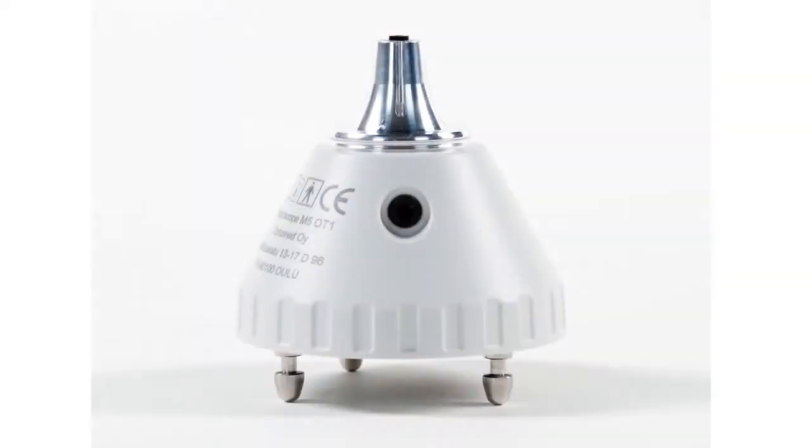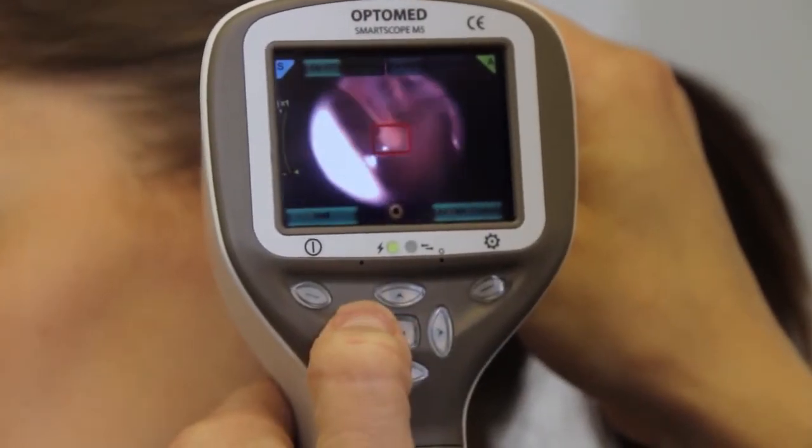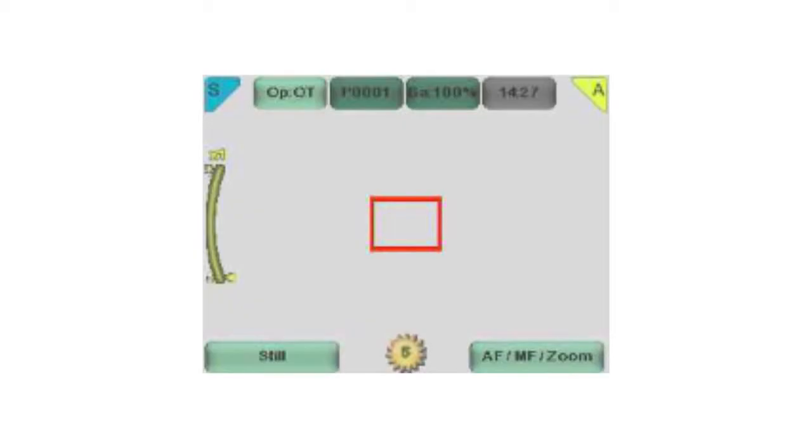Illumination level. The camera has white LED lights as a source. The level of illumination is adjusted by pressing the right and left arrow keys. Altogether, there are 10 brightness levels with a default value of 5.